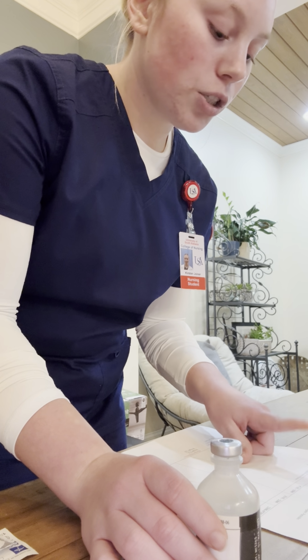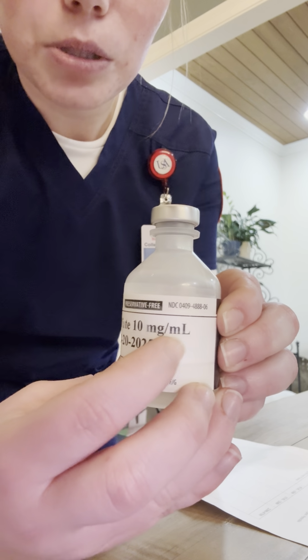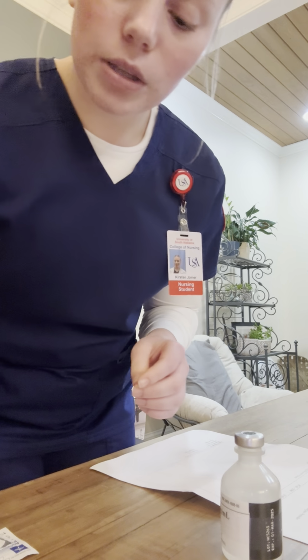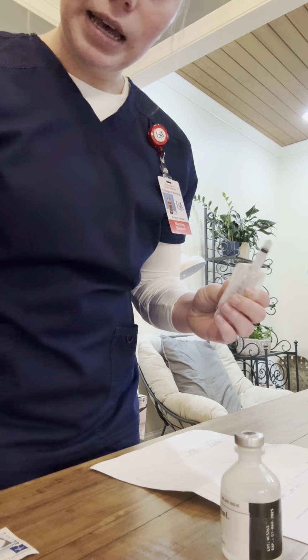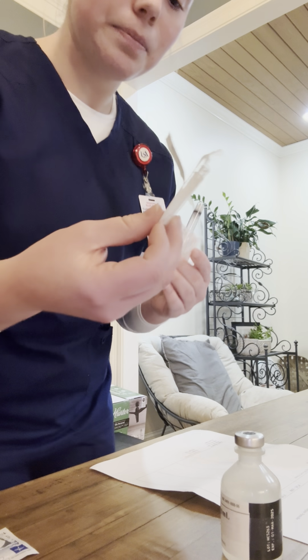My correct dose is 5 milligrams. This is given as 10 milligrams per milliliter. So to get 5 milligrams, I would do 0.5 milliliters. So this is the correct syringe to use. Just open this up. And in order to draw up the medication, I would use a blunt plastic cannula.